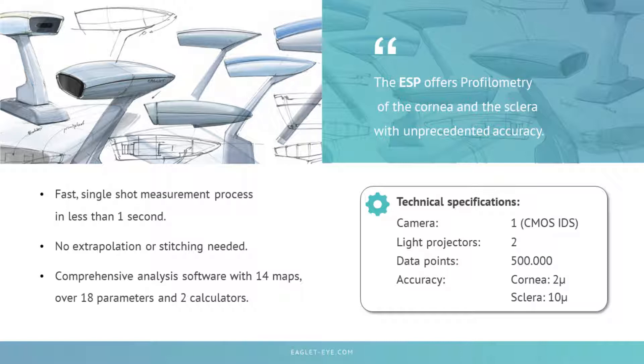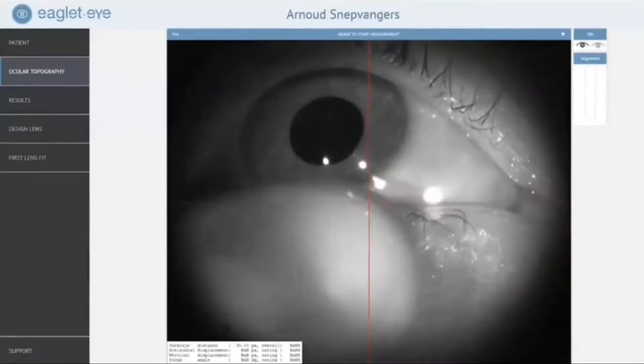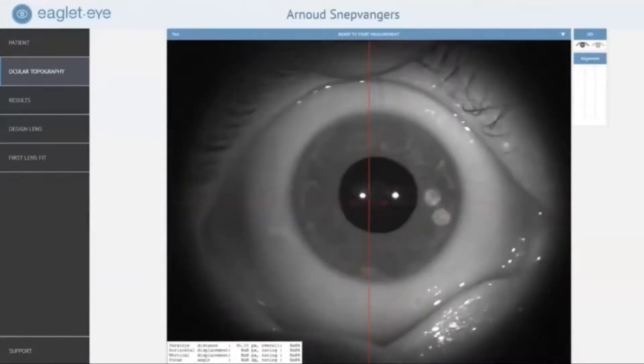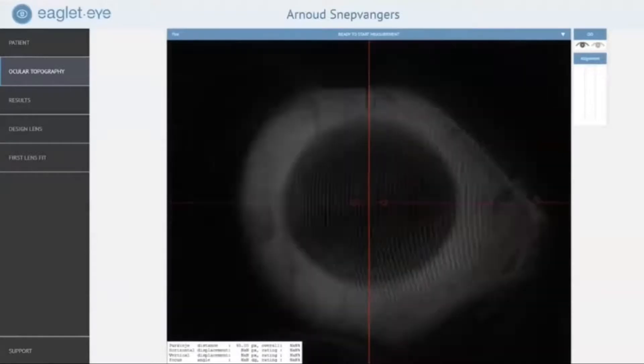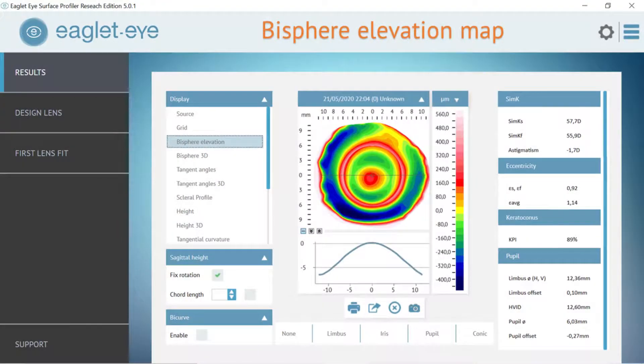Included in the ESP is a comprehensive analysis software. The image capture is easy: we lubricate the eye, pre-align the device on the patient, instill fluorescein, dim the lights, and instruct the patient to look straight ahead. We open both eyelids, do a final check of alignment, and just click. The technician opens the eyelids, directs the patient to primary gaze, aligns the Purkinje images, and checks that a good area has been captured. This gives us the bispherical elevation map, and measurements up to 20 millimeters in diameter are very feasible and realistic.